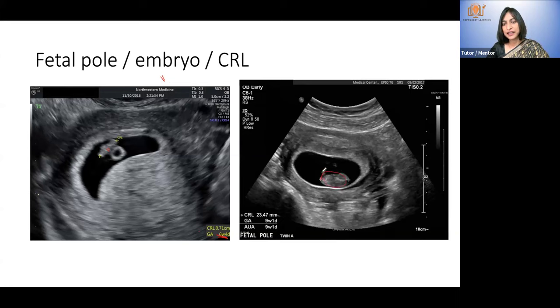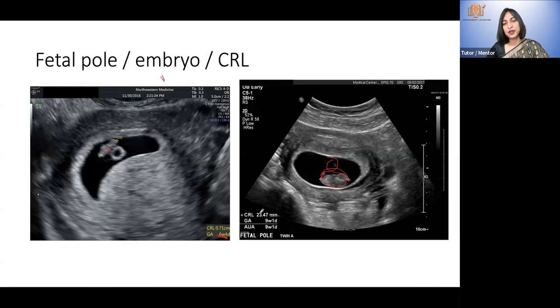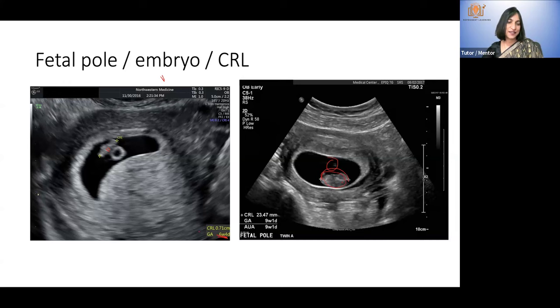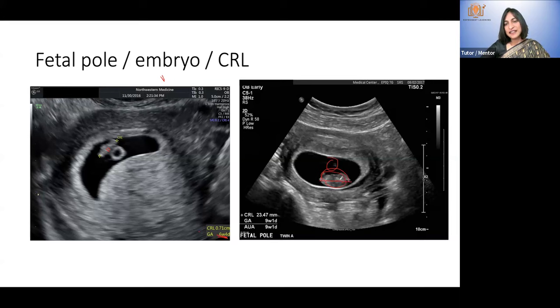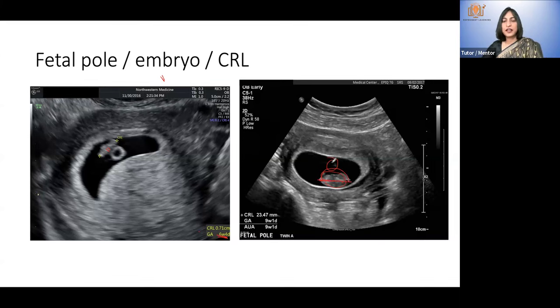Diagrammatically, the amniotic sac surrounds the embryo, and somewhere adjacent you will see the yolk sac if you have good resolution. But at nine weeks it is unlikely to see both the yolk sac and the amniotic sac clearly. This is a nine-week pregnancy where you will definitely see cardiac activity but the yolk sac is gone.